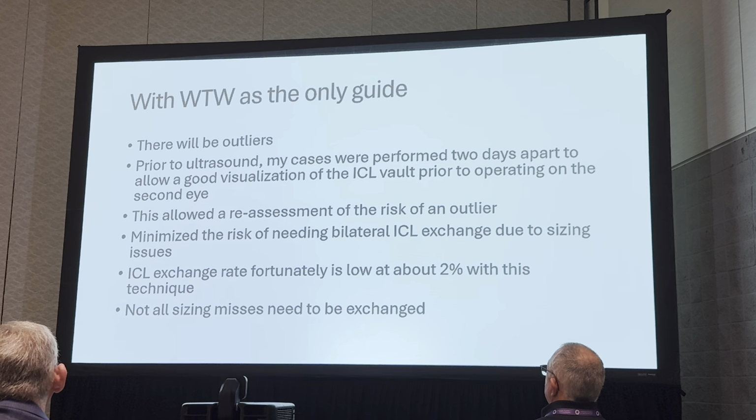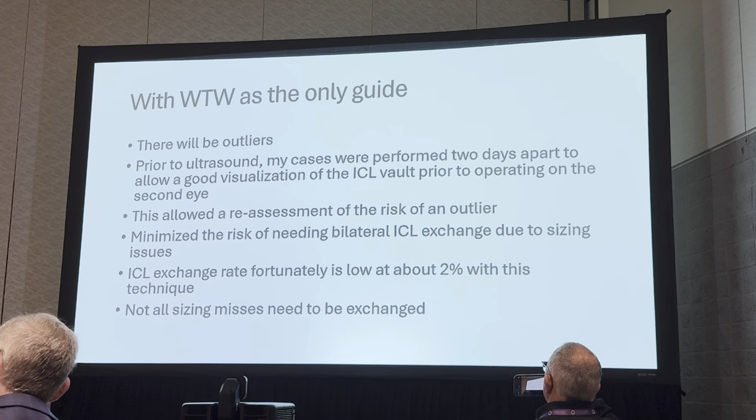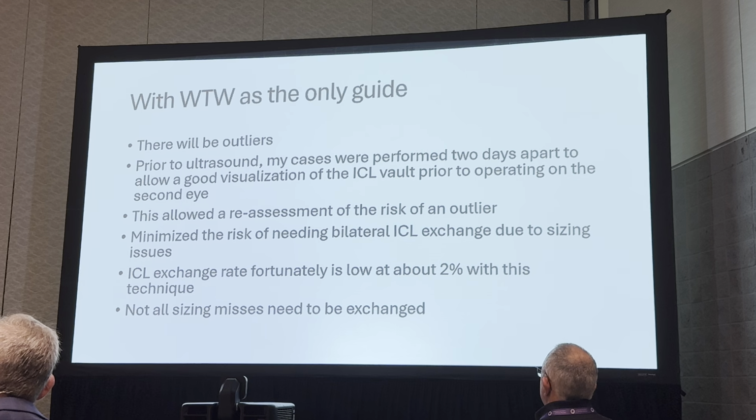Okay, so in my case, what I ended up doing to try to minimize the risk was I did them on different days, kind of like Dr. Lin was saying. Every case I did, the first eye, the non-dominant eye, and then a couple days later, the next eye. And I used the day one post-op vault to gauge, okay, how can I do this as safely as possible using white to white?